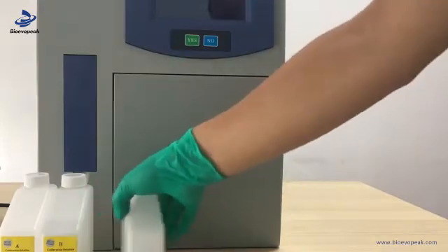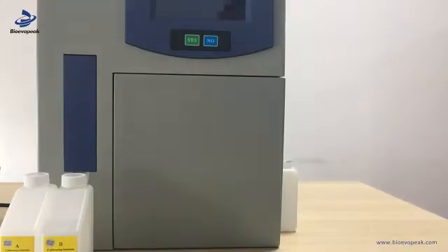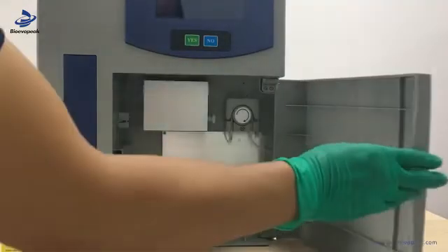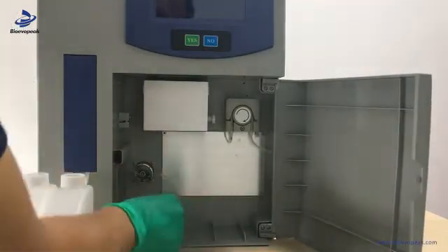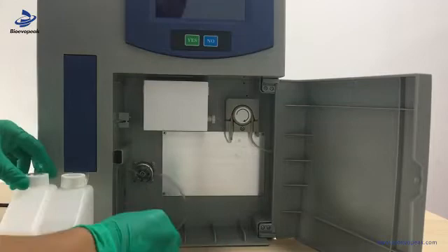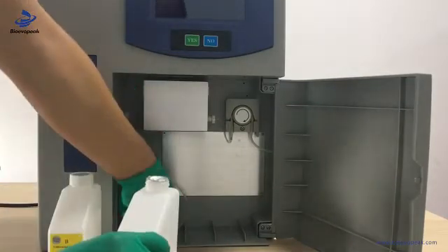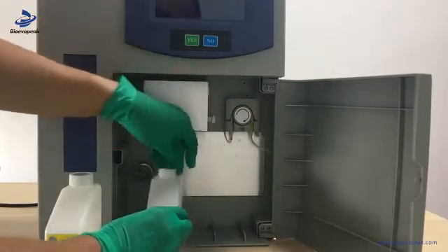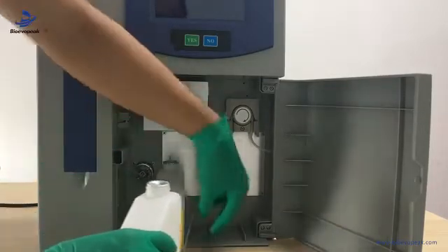Now we put the waste bottle outside of the machine and put the tube into it. Then we can open the door. We put reagent calibration A and B in the right position. We need to pay attention: A is at the downside of the distribution valve, and B is on the right side.